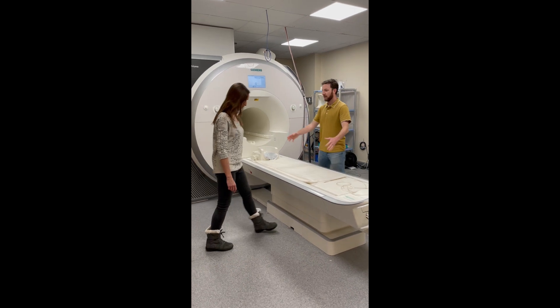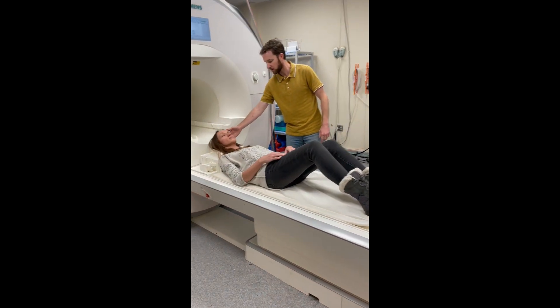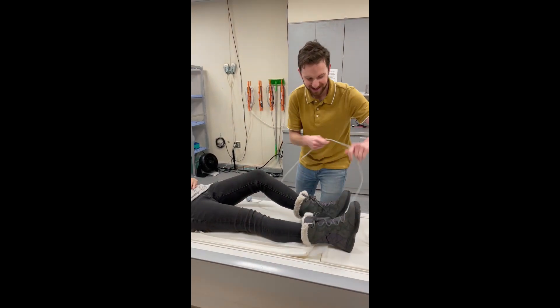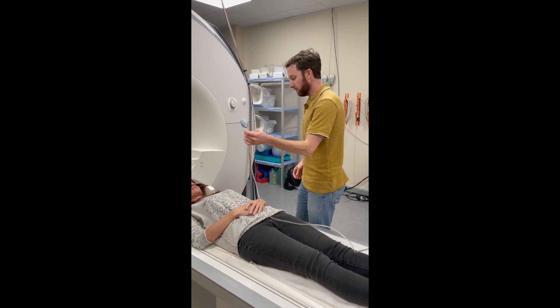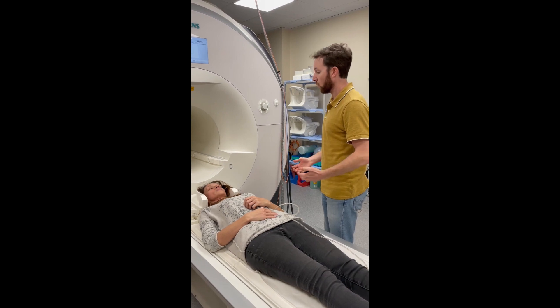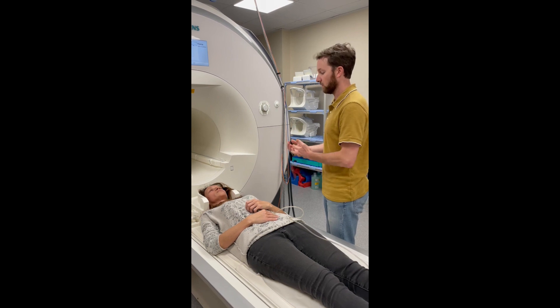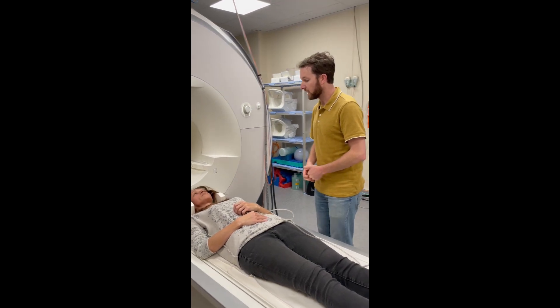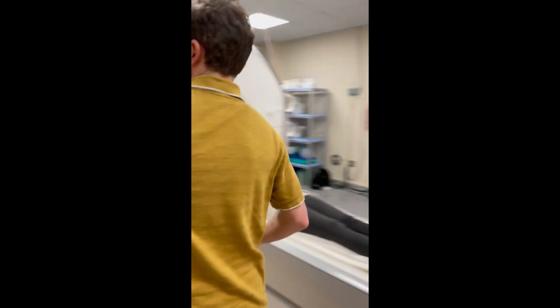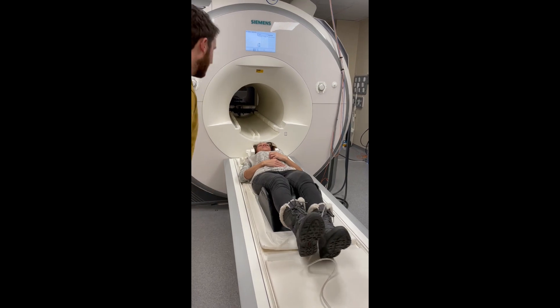Go ahead and take a seat on the bed and rotate yourself so that your head is on the cushion inside of the head coil. Please go back slowly and watch where your head goes. I'm going to give you this squeeze bulb, which you can have in your hands during the session. If at any point you'd like to get in contact with us while the scanner is making a lot of noise, please squeeze that — we'll stop the scanner and check in with you immediately. Would you like a leg rest and a blanket?